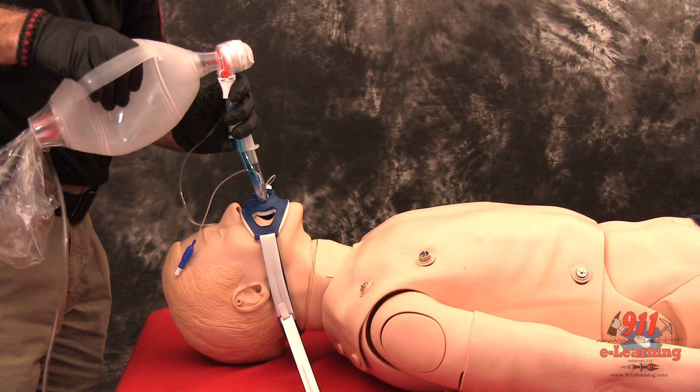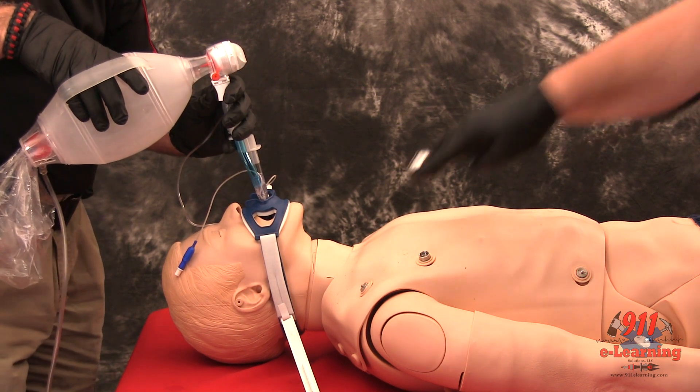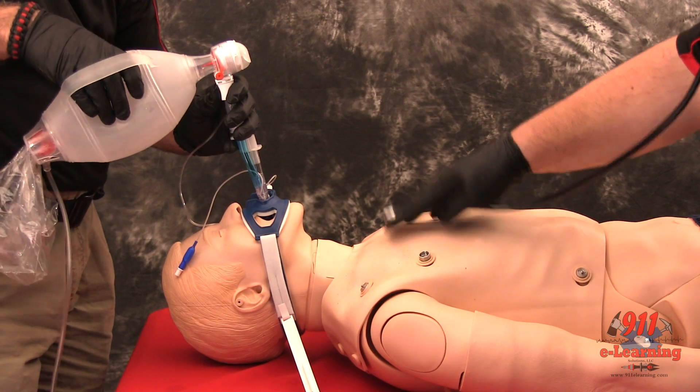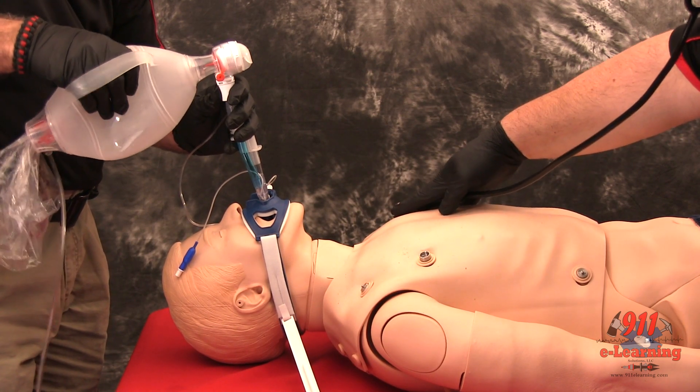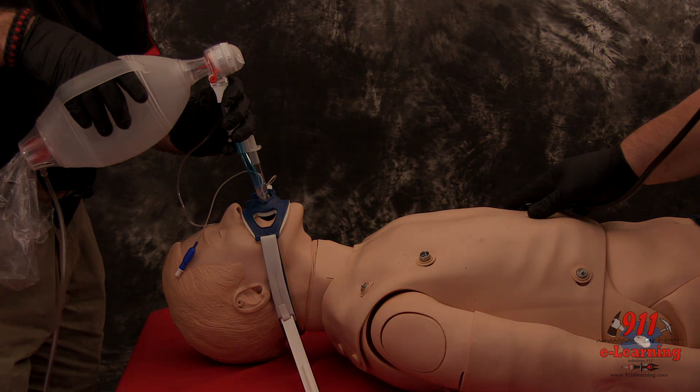It is strongly recommended that the airway, if equipment is available, be monitored continuously through capnography and pulse oximetry. It is strongly recommended that an airway evaluation form be completed with any device use.